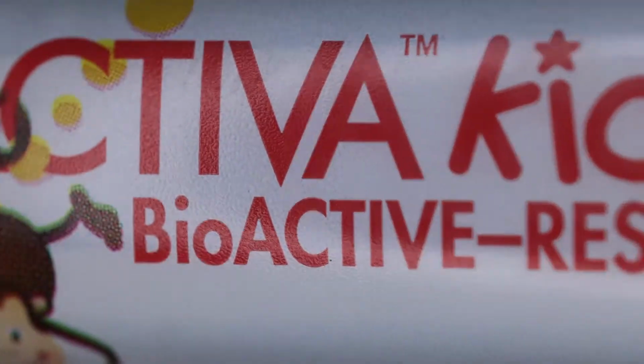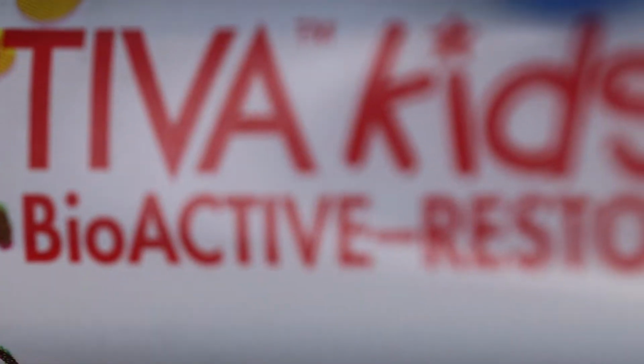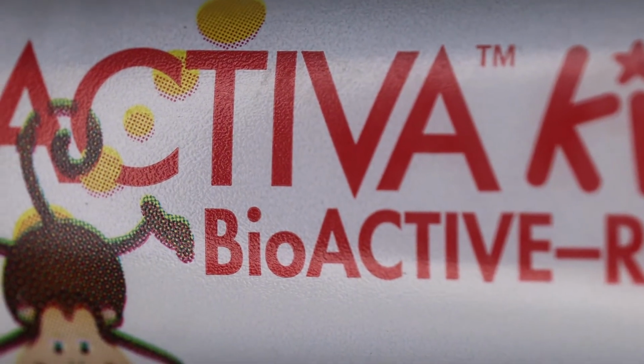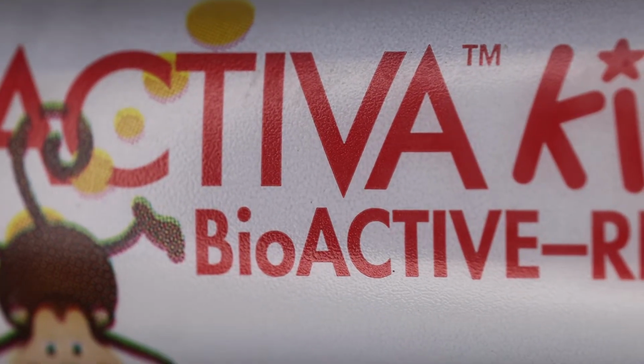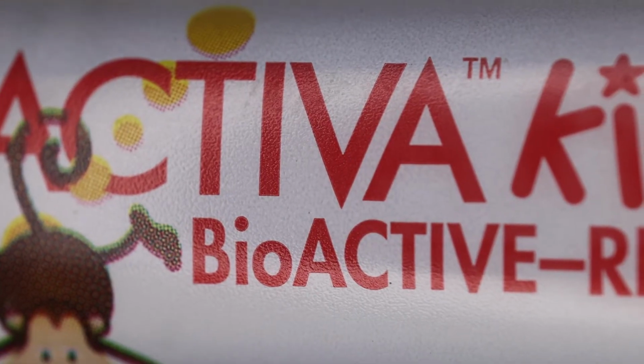This bioactive restoration works continuously inside the patient's mouth, trying to remineralize the tooth structure that has already been demineralized.